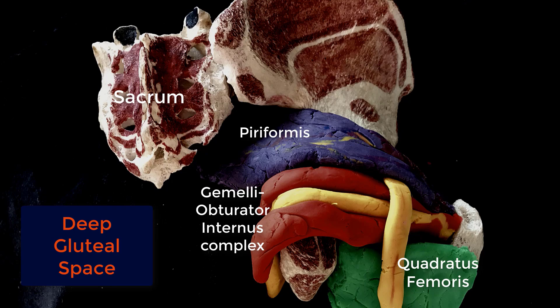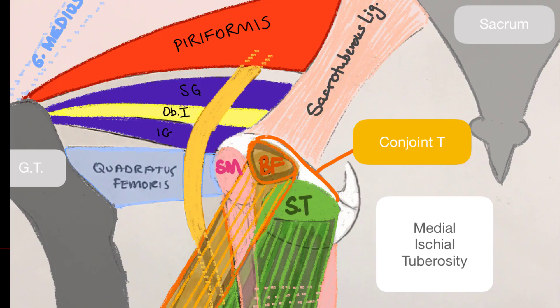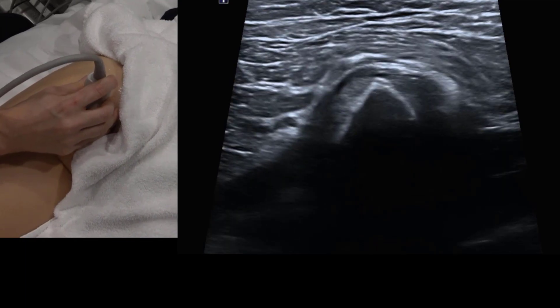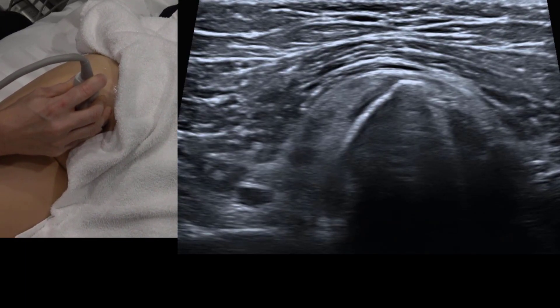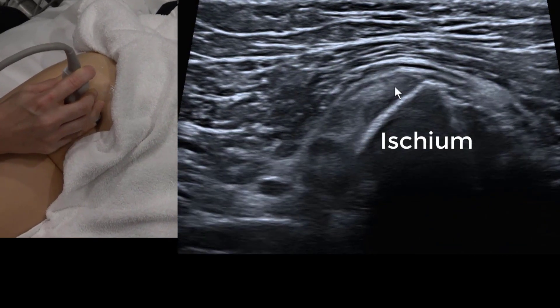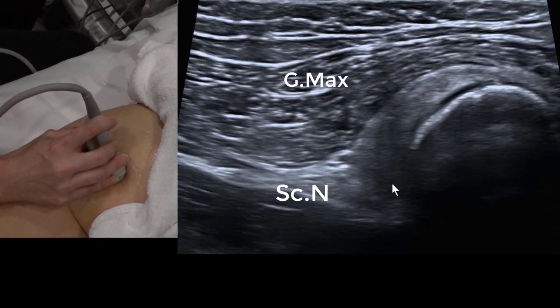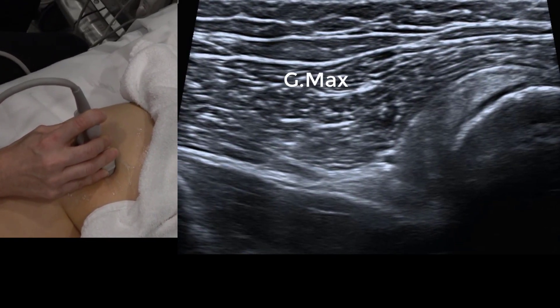The deep external hip rotators are best accessed from below, moving from most inferior to superior. A good initial landmark is the ischium — place the probe in transverse about 6 to 10 centimeters above the inferior gluteal fold. We can identify the ischium, the hamstring origin, the conjoint tendon, and the semimembranosis more laterally and anteriorly.